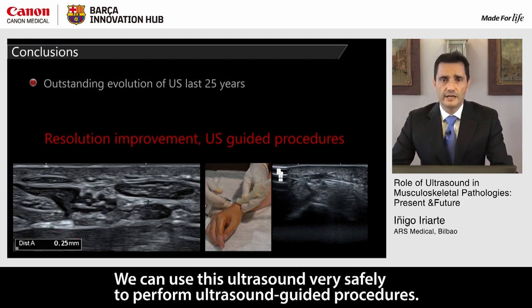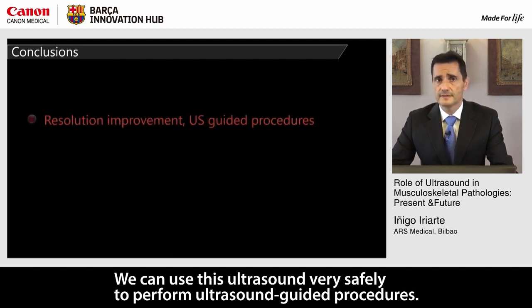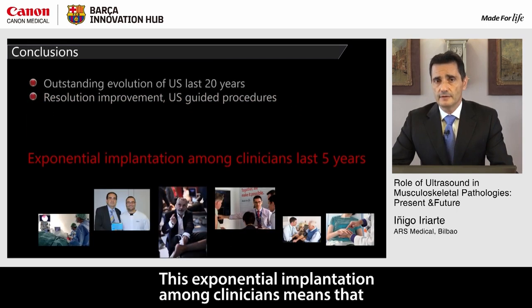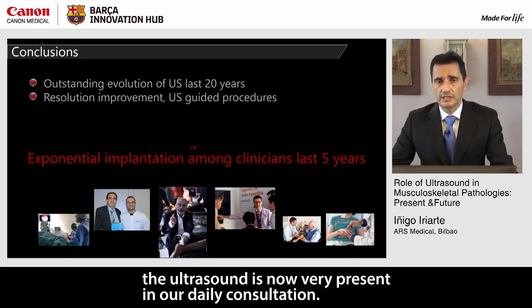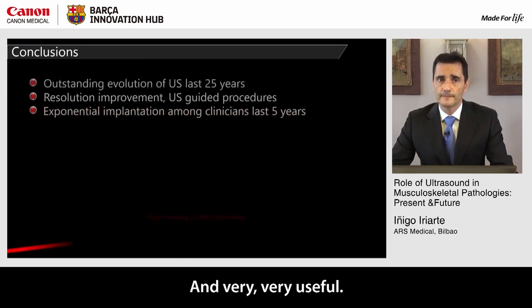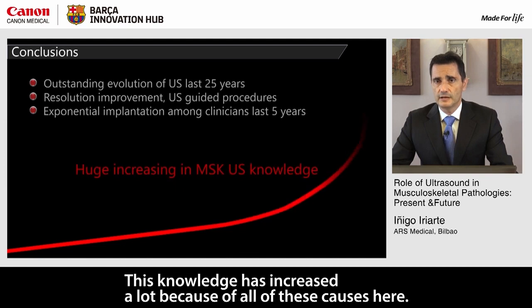We can use this ultrasound very safely to perform ultrasound-guided procedures. There's an exponential implantation among clinicians, so ultrasound is now very present in our daily consultation and very, very useful. This knowledge has increased a lot because of all these causes here.